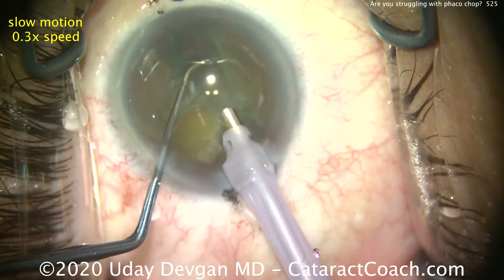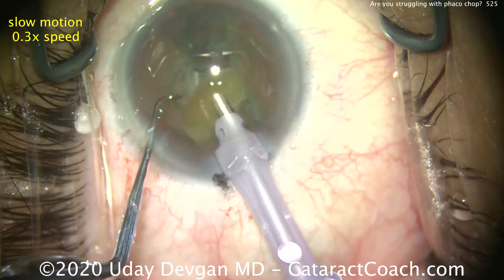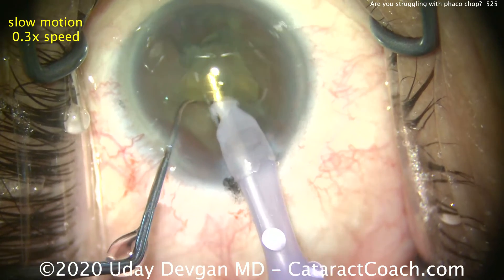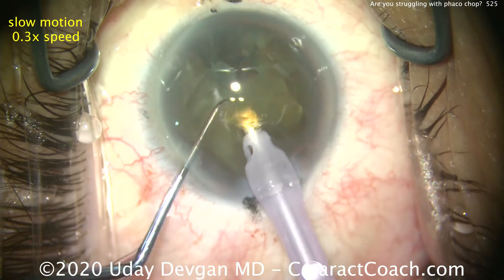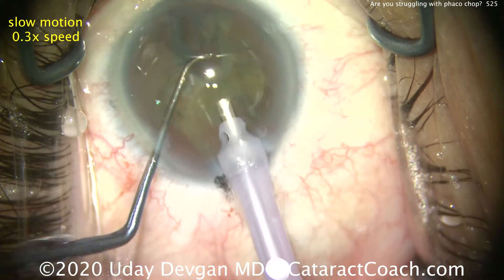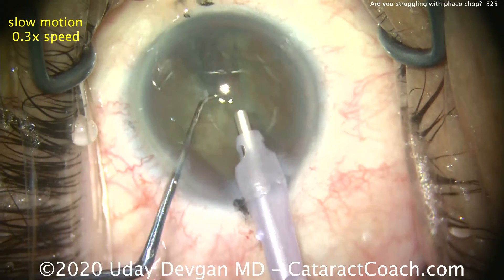Now we have a small fragment. We'll take out this small fragment with the FACO probe. We're operating about the iris plane. We just give a little bit of FACO energy. The chopper just pushes the piece in front of the FACO probe — notice that pushing action. So we take our time with a swirling motion back and forth, only applying very little energy.